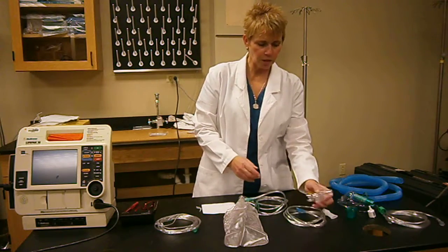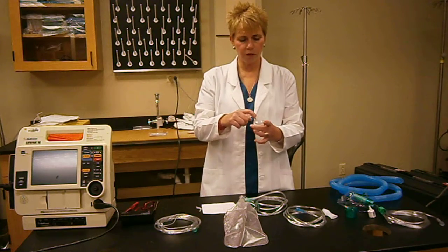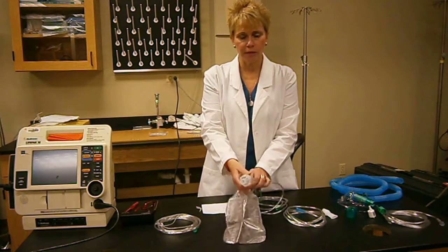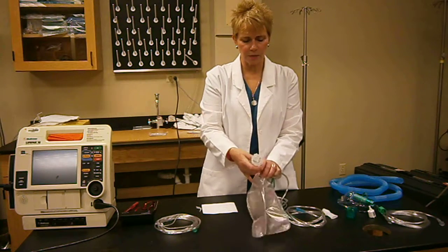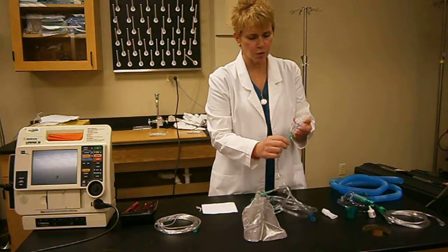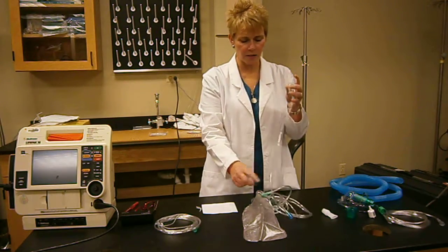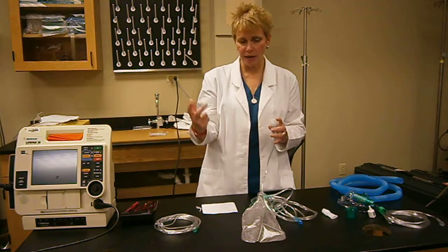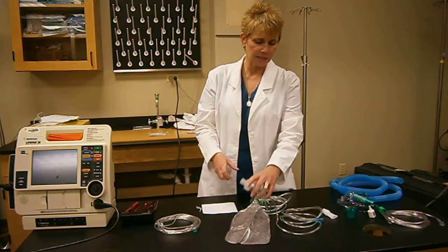If you have a patient that does need a nebulizer treatment, you can hook your nebulizer treatment up to this, and you can separate the mask and apply this system to the bottom of the mask, and then apply your oxygen to it, because sometimes patients will need to maintain that higher level of oxygen. Rather than take the mask off and give them a non-rebreather treatment, you can hook it into the existing mask.